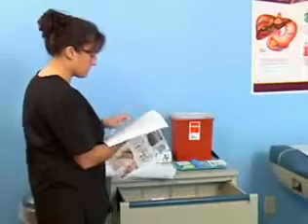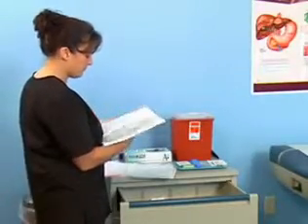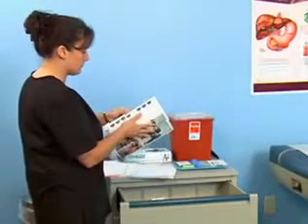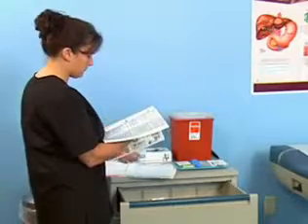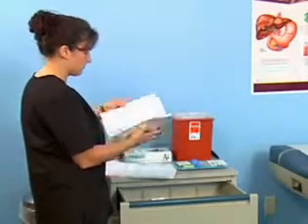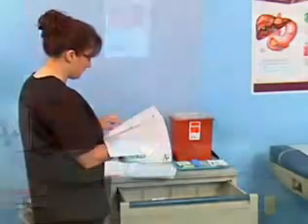Select the proper evacuated tubes for the tests ordered by the physician. The physician has ordered a CBC, a basic metabolic profile, and a renal function profile. The laboratory directory indicates that you need a lavender tube and 2 serum separator tubes.